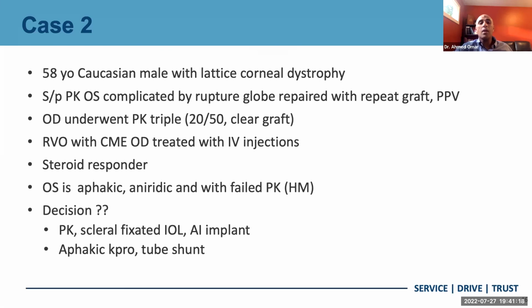The iris implant was behind the tube shunt. But again, the patient, for some reason, developed significantly high pressure in the post-op period, and also needed a tube shunt revision right after the surgery. So even option one, the artificial iris implant, supposedly should not cause any issues with pressure, but it could, and the patient could eventually still need a tube shunt as well.